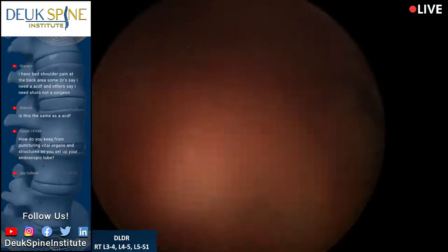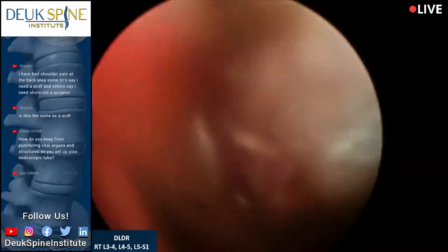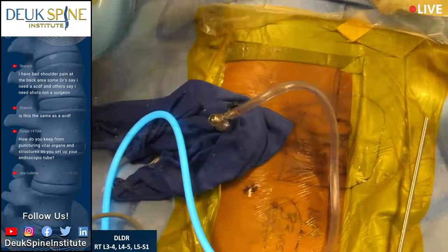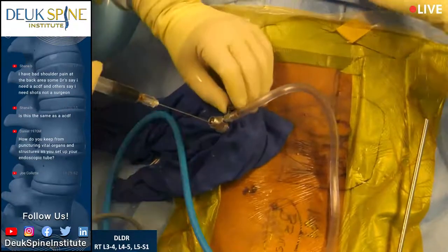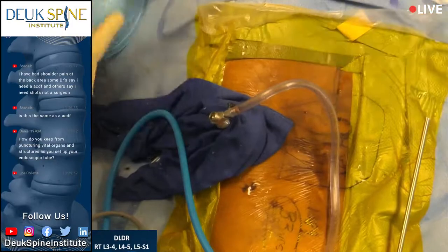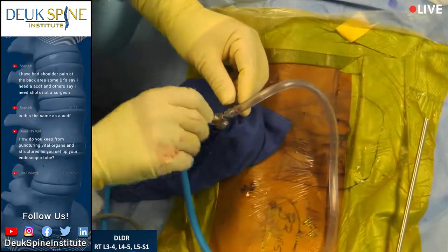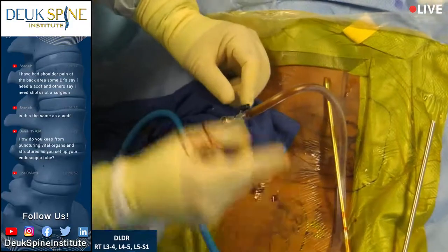All right, done. Good job, everyone. Thank you for your help today. Folks, type up your questions. I'll come answer them for you. And let's just take a look at this incision here. It's incredible. The whole surgery for 3 discs was done in under an hour, and it was done with a 7 millimeter incision.